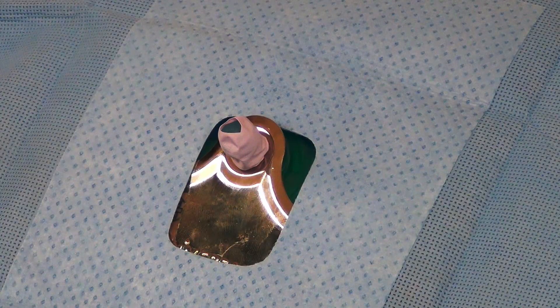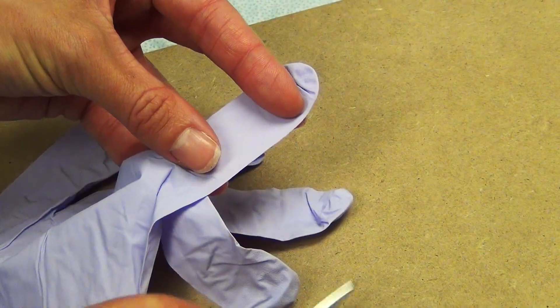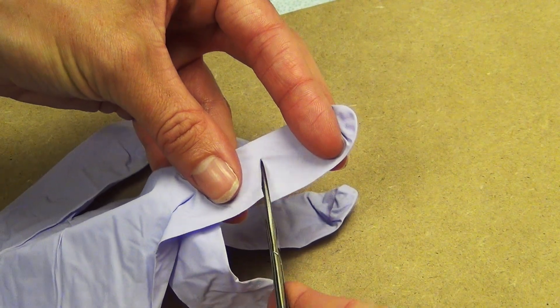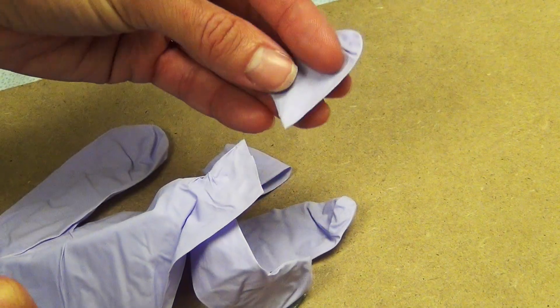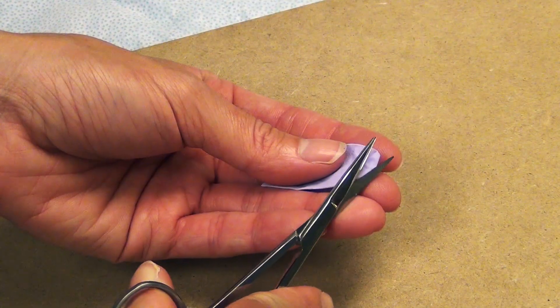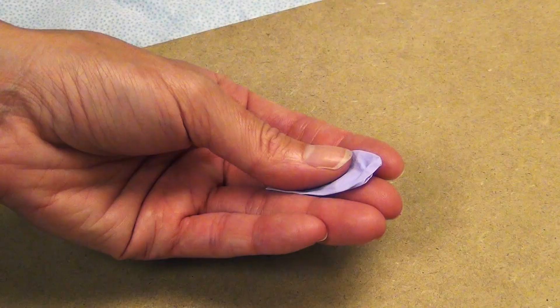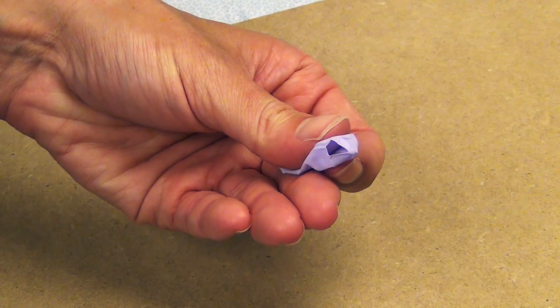This model can be easily constructed in a few simple steps. To begin, the pinky finger of a nitrile glove is removed with scissors. A small hole is cut in the tip of the finger of the glove to simulate the opening of the foreskin.